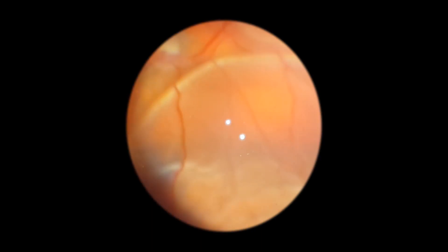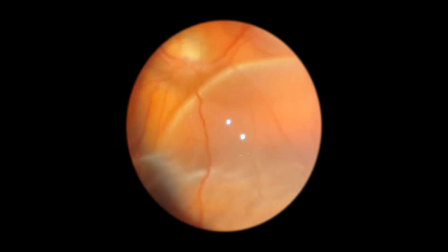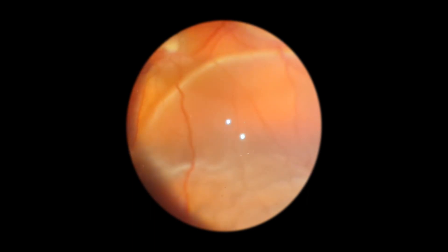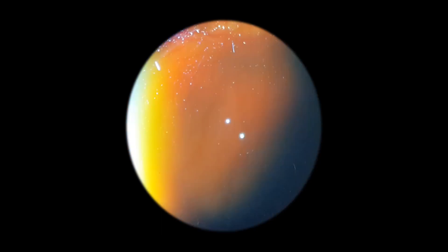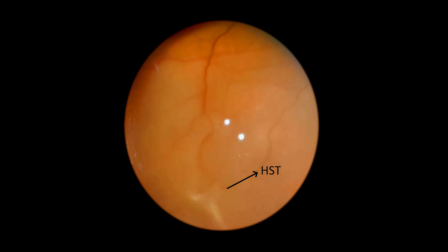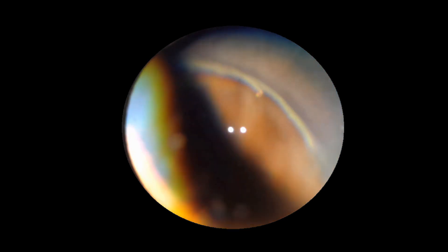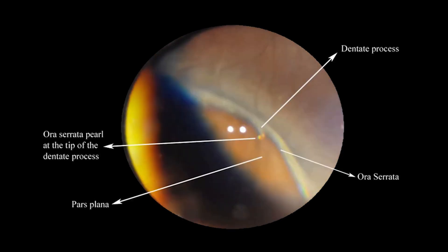This is a patient with a combined rhegmatogenous retinal detachment and choroidal detachment. You can see that the retina moves relatively freely while the choroid under the retina is more rigid. This is the sweeping movement of examination reaching up to the periphery to locate the horseshoe tear. This is an ora serrata pearl — a clinical curiosity. You can see the dentate process, the pars plana, the ora serrata, and the ora serrata pearl at the tip of the dentate process. They are usually seen in 20% of individuals and are thought to be drusen-like bodies in the periphery of the retina.